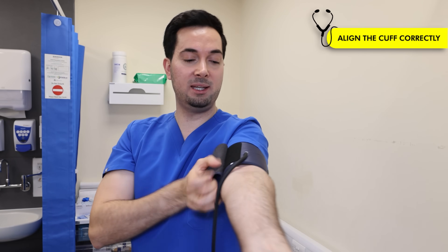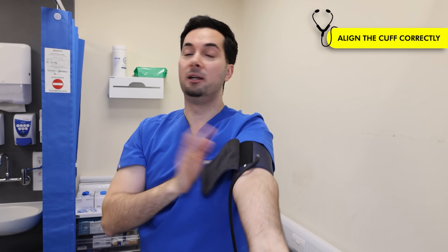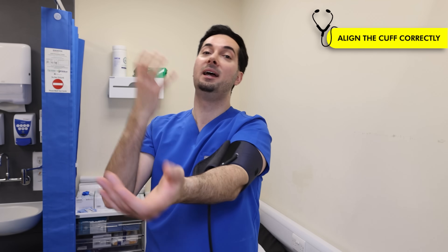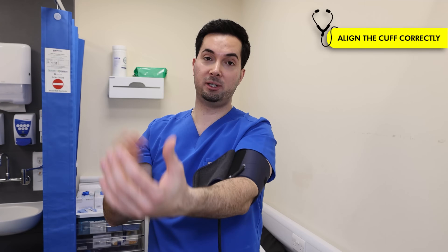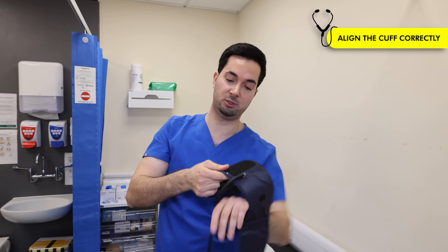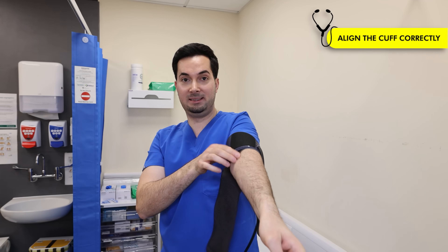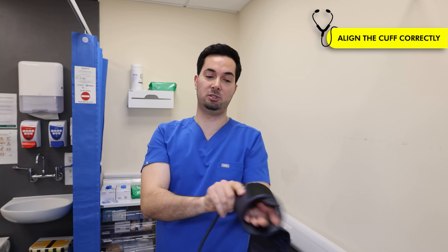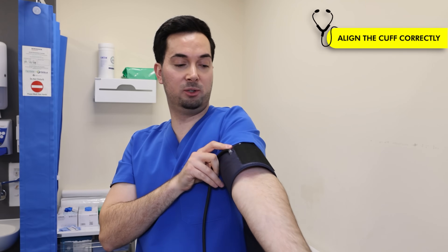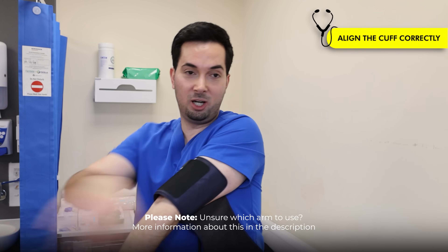Step four: aligning your cuff correctly. A&D Medical cuffs all come with a white dot that needs to be aligned with your middle finger. If it's not, the cuff won't be able to detect vibrations and measure your blood pressure accurately. Other monitors use different markers, but ours use this white dot. Also, the white dot should always be pointing downward — I've seen patients put the cuff on the wrong way with the white dot facing up, which makes it very difficult to even close the cuff.